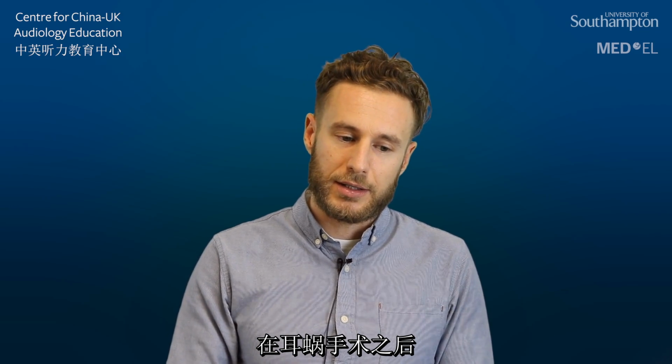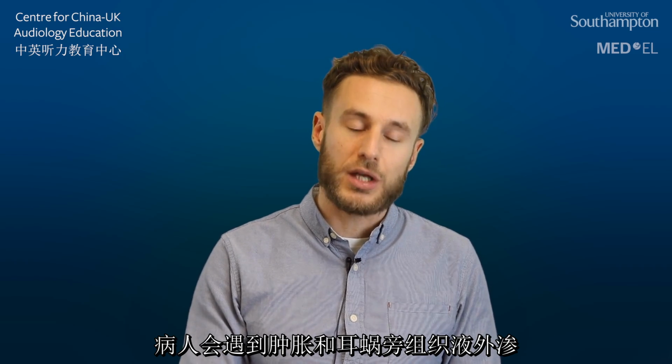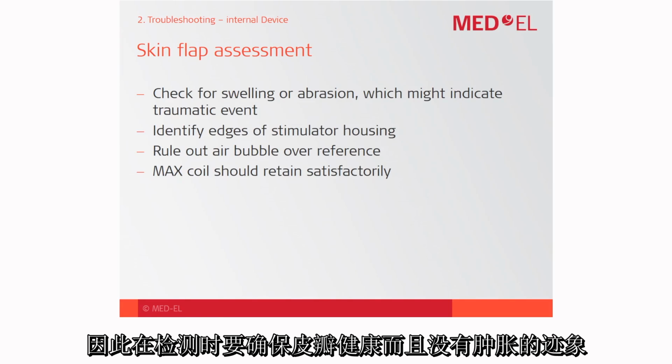So especially after the implantation, you are typically confronted with swelling, or also some fluid could reside over the implant. So make sure that the skin flap is healthy and does not show any bruises or swelling.